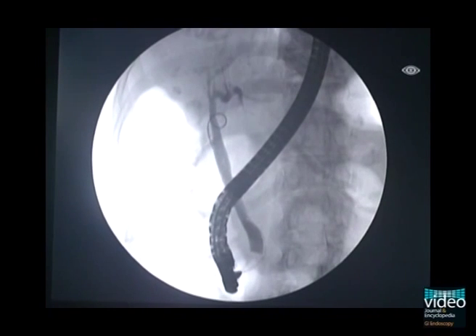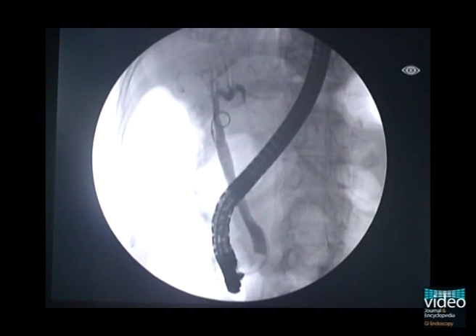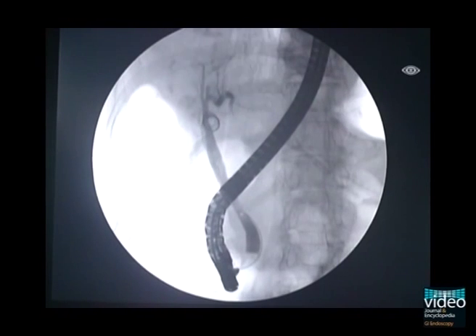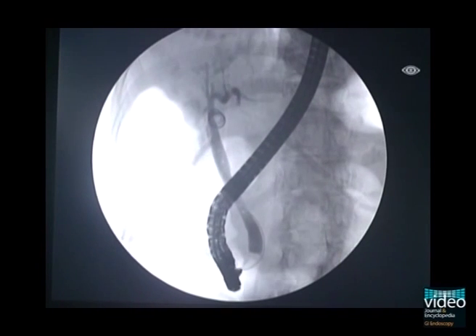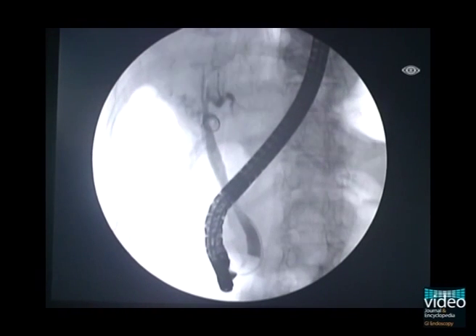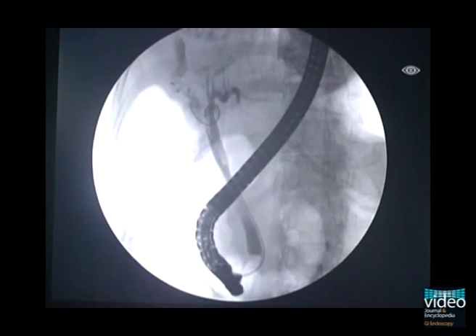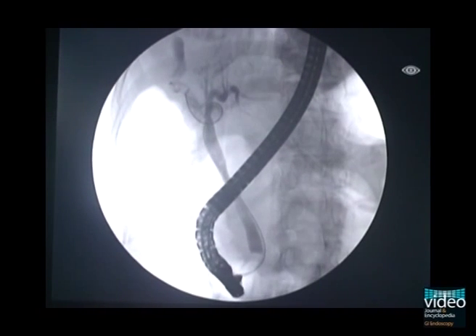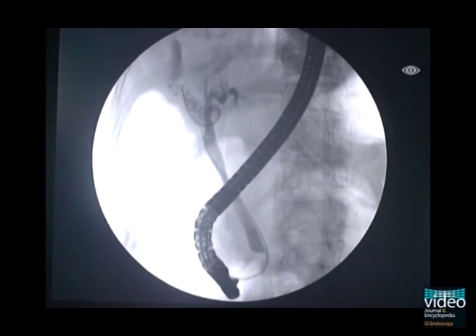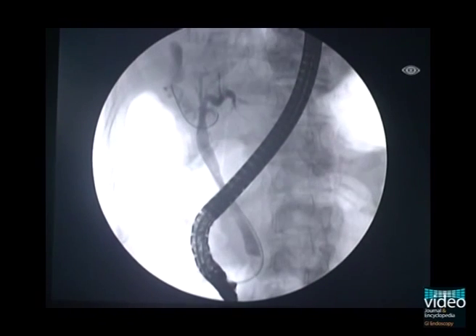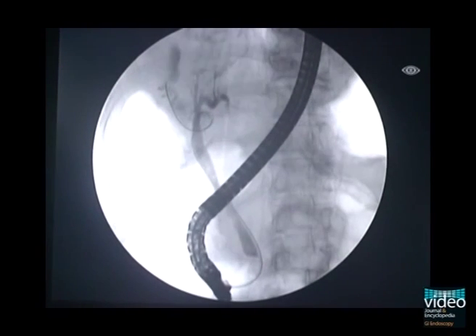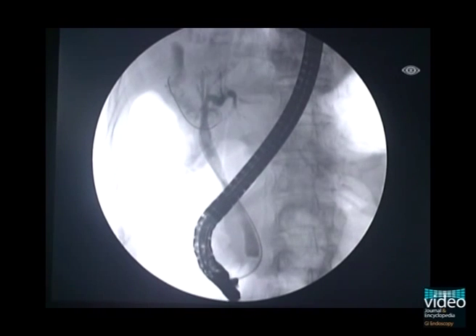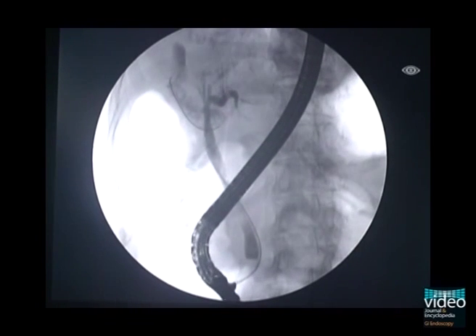After successful bile duct cannulation, negotiation of the cystic duct may be difficult. In such cases, a guidewire preloaded catheter using a rotating sphincterotome, such as an autotome, may be helpful in negotiating the cystic duct by rotation of the papillatome to search for the cystic duct opening. Also, to search and visualize the configuration of the cystic duct, retrieval balloon-occluded cholangiography is useful.